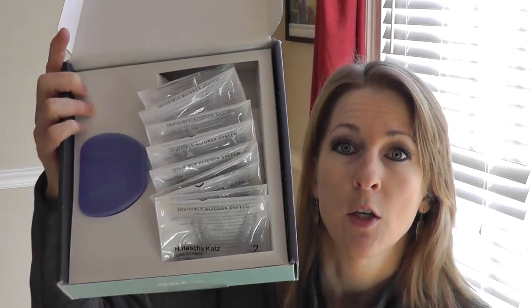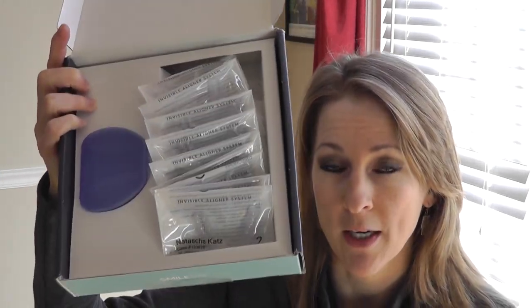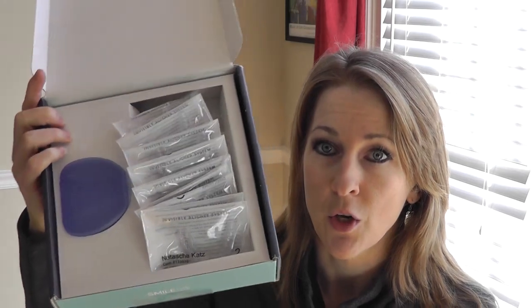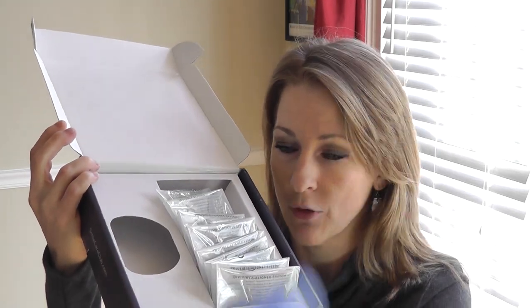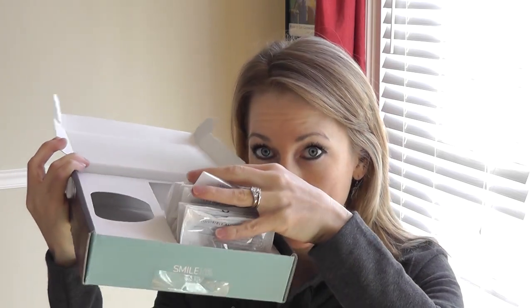So I have 10 trays. My treatment plan calls for 10 trays and it's only upper. So this is what you'll get — you get a Smile Care Club kit, you get the little thingamajiggy to hold your aligners in, and then you get whatever your treatment plan is. Mine's 10, so I went ahead and got all 10.